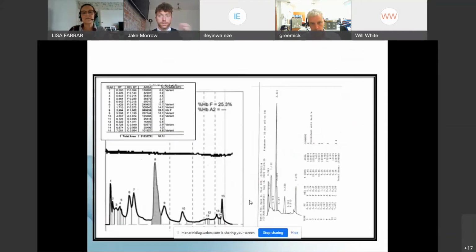In this second example, it's just another example of a carrier hemoglobin. Again, we have fetal hemoglobin, acetylated fetal hemoglobin, because wherever you have large quantities of F, 10% of that will make up as acetylated hemoglobin. We've got hemoglobin A, and then we've got hemoglobin C. And in this case, it's in the C position at 0.994 to C, which again, 99.9% sure that it would be a hemoglobin C, and I'd be happy with that diagnostic result. And it also gives me the indication on where to go phenotypically if I'm going for differential diagnosis and doing isoelectric focusing and tandem mass spec.